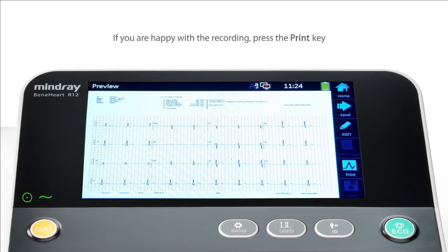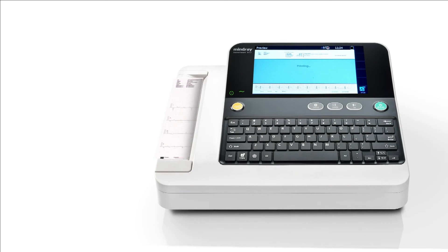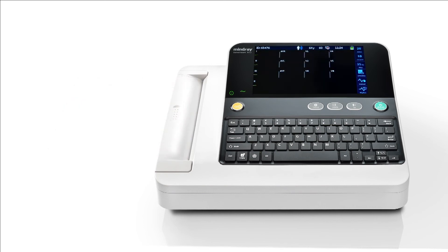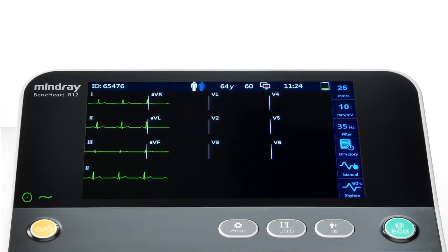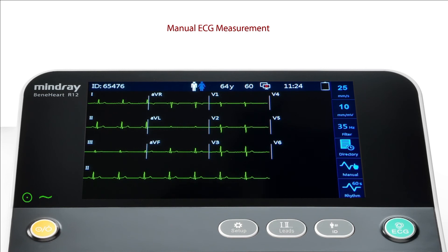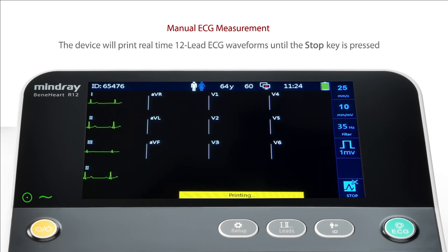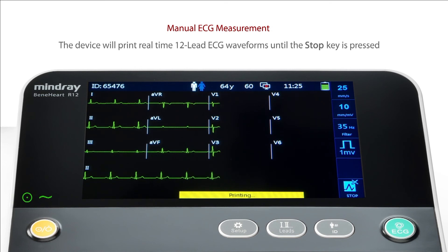If you are happy with the recording, press the PRINT key. To acquire a manual measurement, press the manual key. The device will print real-time 12-lead ECG waveforms until the stop key is pressed.